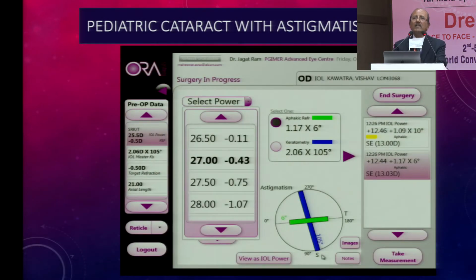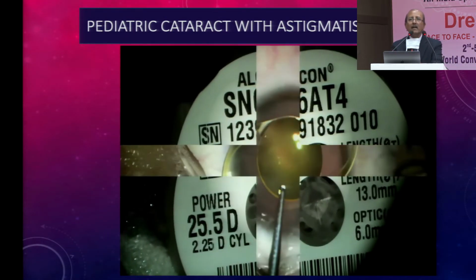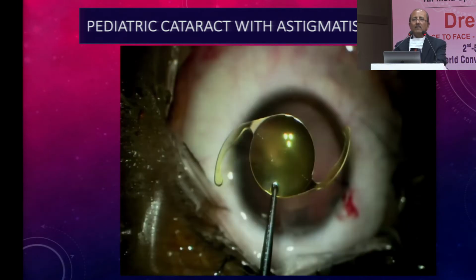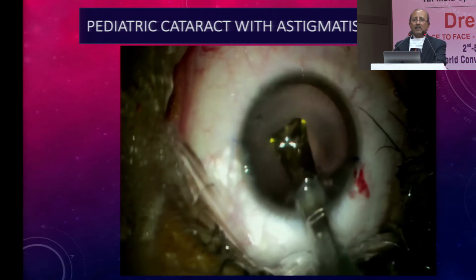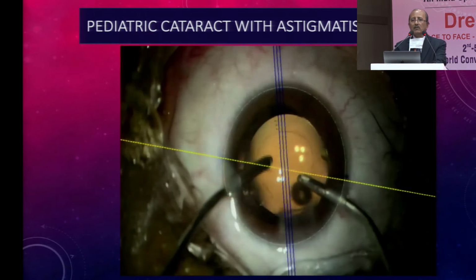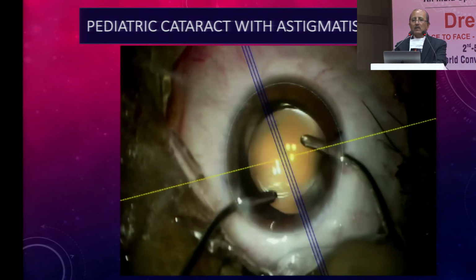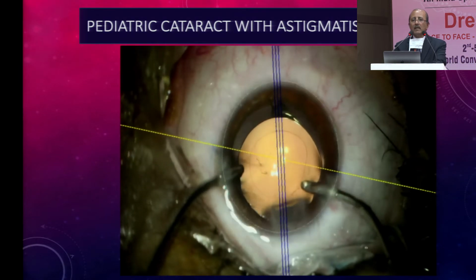So adequate IOP has to be there, and now it will calculate the IOL power. And then actually in children, if the child is less than 6 years of age, or an infant in the first 2 years of life, we have to undercorrect. It is not exactly the same power which comes out. So undercorrection is done particularly in children.